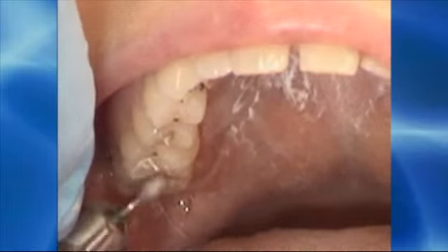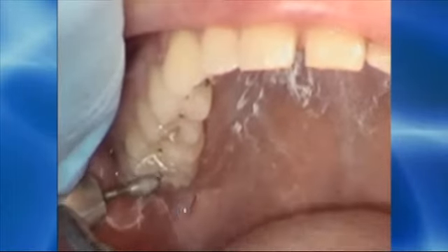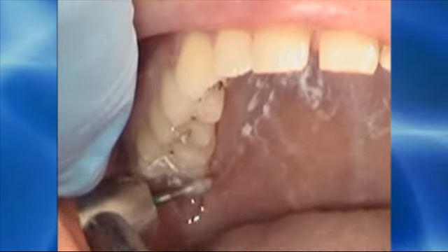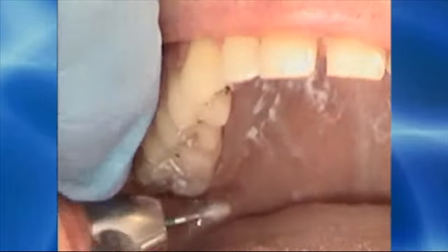I'm leaving the contact in the marginal ridge area, but treating the buccal aspect of the first molar, and doing the same thing here on the buccal aspect of the upper second molar. Also refining a little bit on the lingual, just gently touching the teeth, removing any of the lace-like contacts.